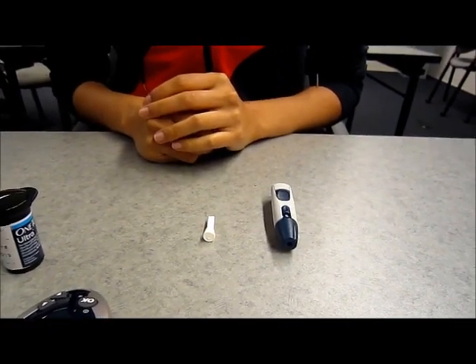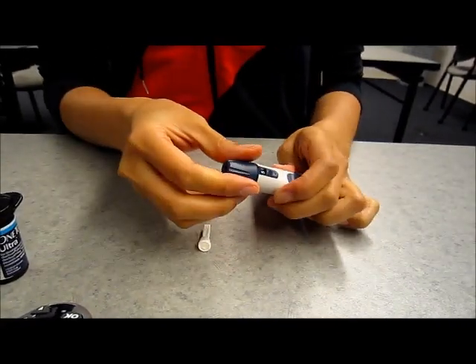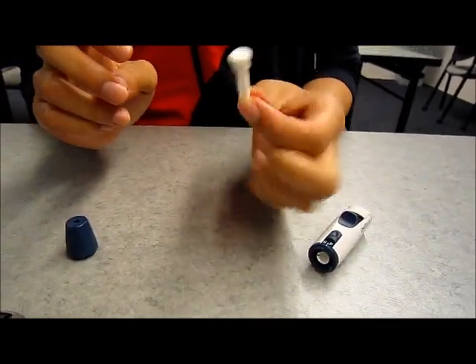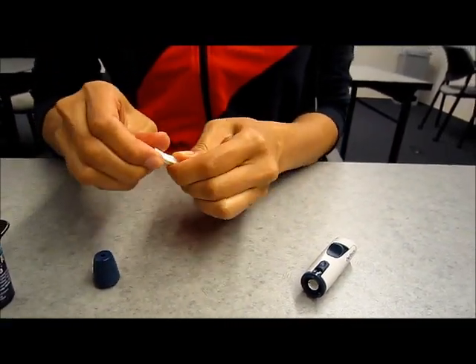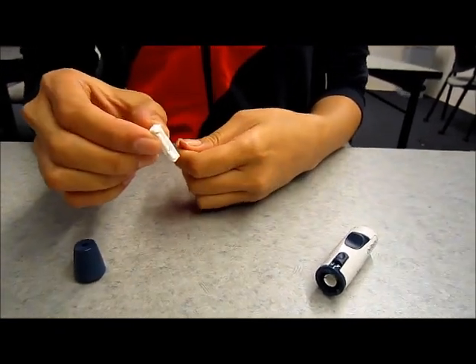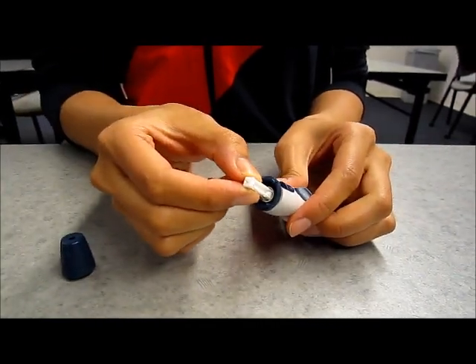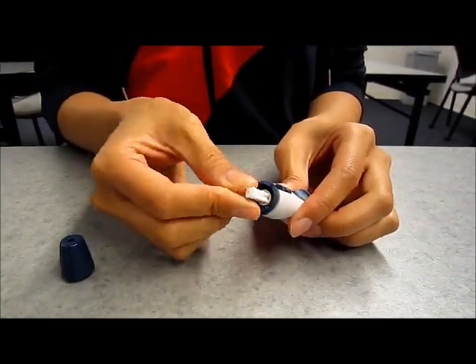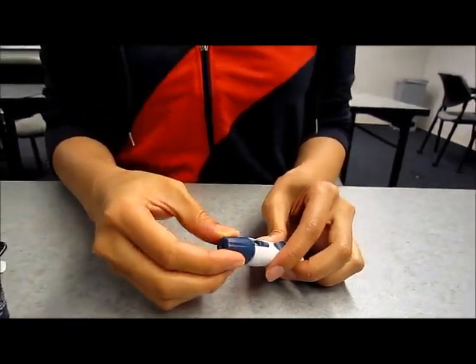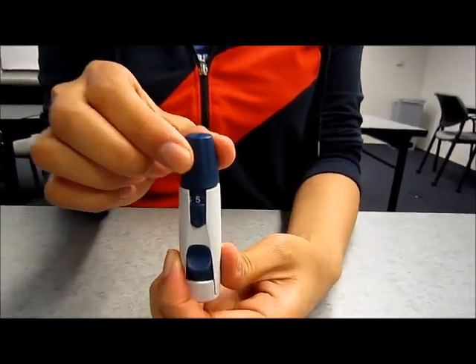Step 3: Load the lancet device. Take off the top of the lancet device and grab a one-time-use lancet by twisting off the cap. These are single-use lancets — never reuse or share with another person. Insert the lancet into the device as shown, then close the top. You can twist the top of the lancet device to adjust the depth of the needle.